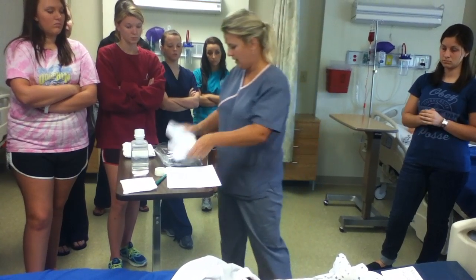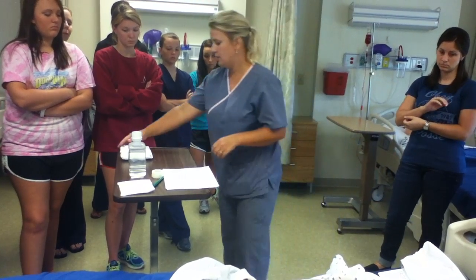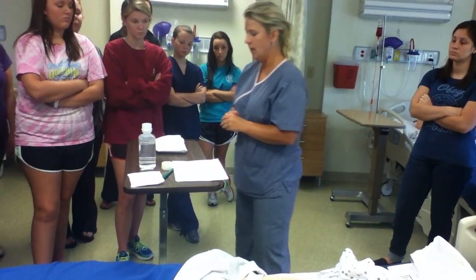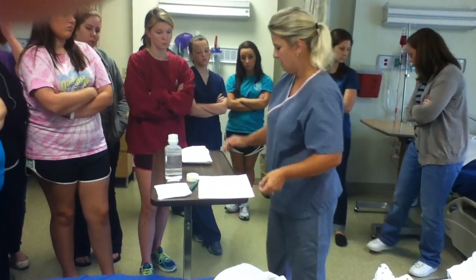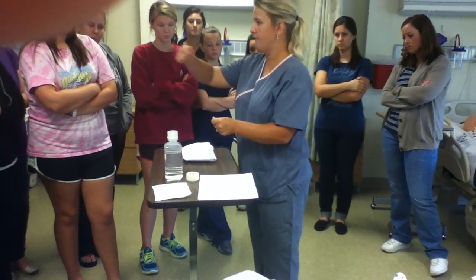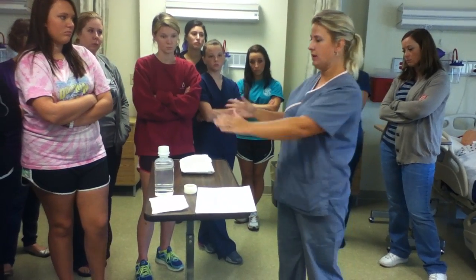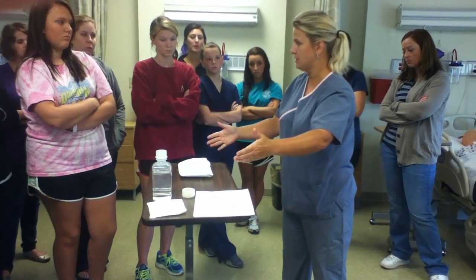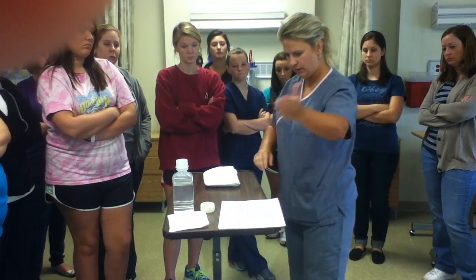Okay, so this stuff right here, I'm going to put it to the side because it belongs to somebody else. And then this is your sterile field. I'm going to show you guys how to open up a sterile field. There is a way to open it. What you need to do is open the first flap away from you. The hardest thing you're going to have to do is figure out how to get everything on this table. I promise. Make it easy for yourself. See how I move this stuff down? When you open it up, move that stuff.